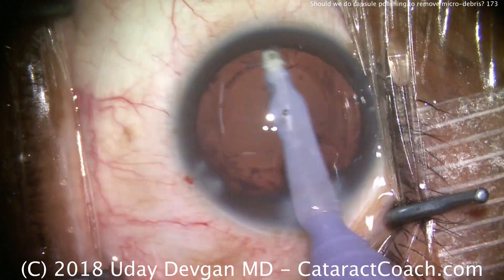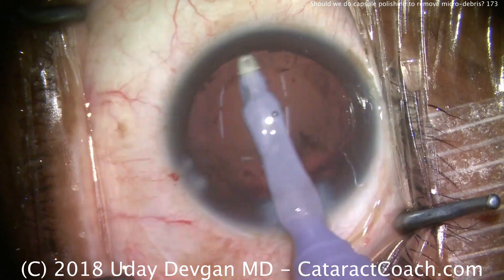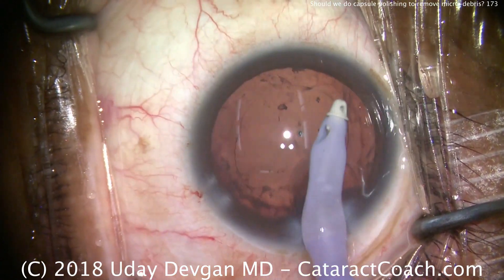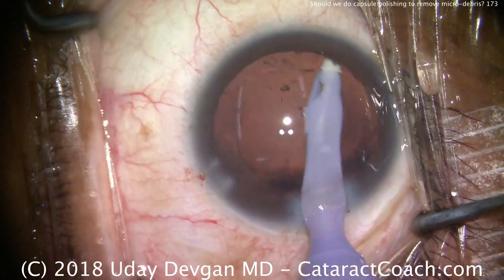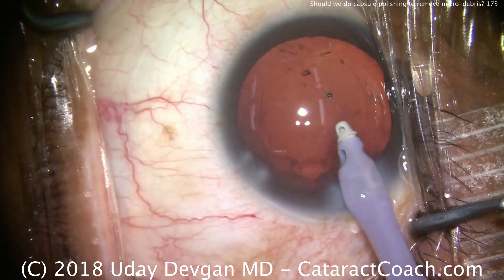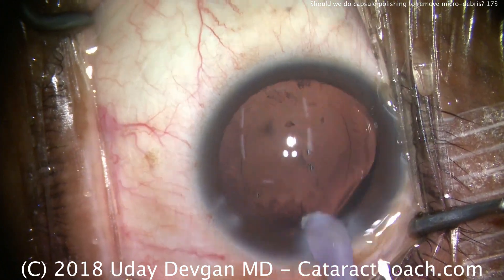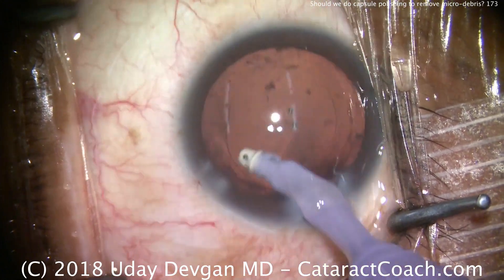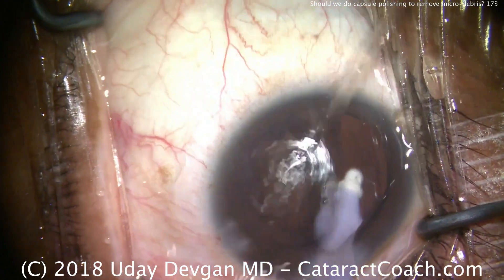I'll go under here and get that last bit of cortex out. Then what we're going to do is actually vacuum the undersurface of that anterior capsule, and clean out the capsular bag as best as we can. Now in the sub-incisional area, it's not as easy to get underneath to polish the undersurface of the bag.